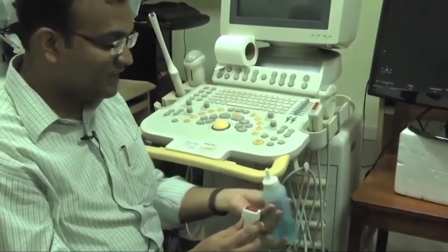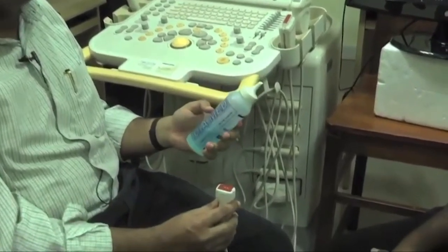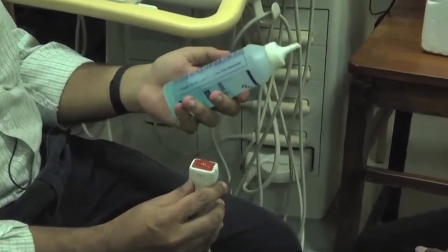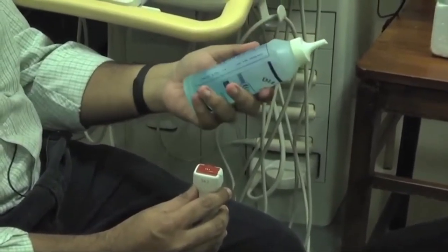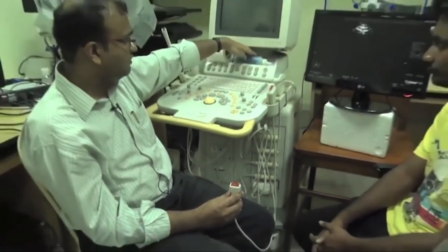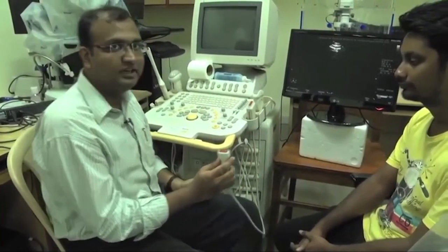Now, you can see as I put on this gel, which is basically just a sonologically conductive gel. It is nothing other than some gelatin and water and some preservatives mixed together, and it's perfectly non-toxic for external use, although it's never suggested that you try eating it, because it's not an edible product as such.